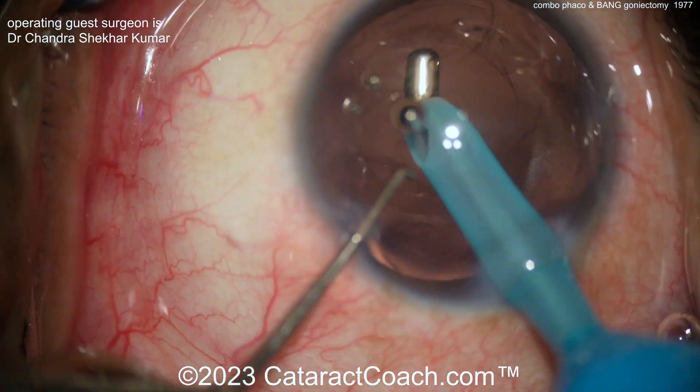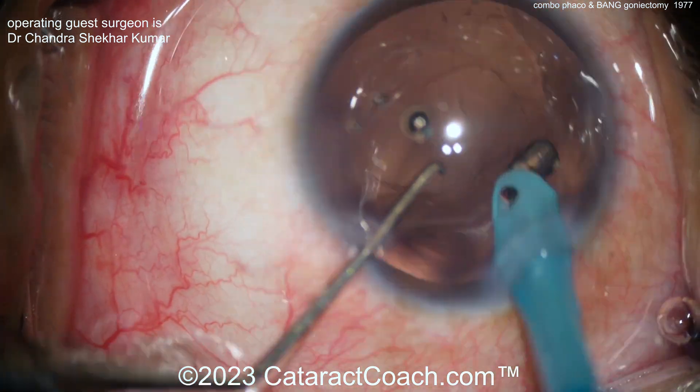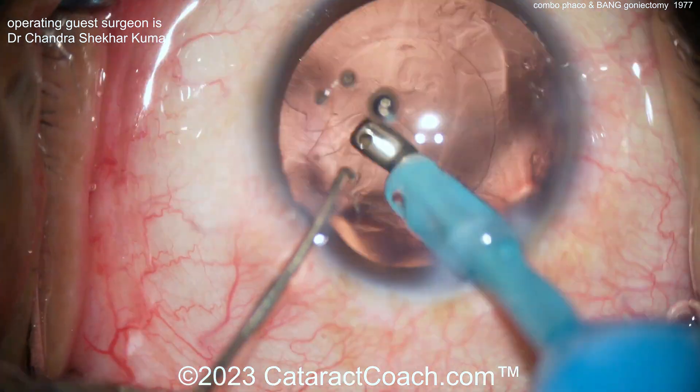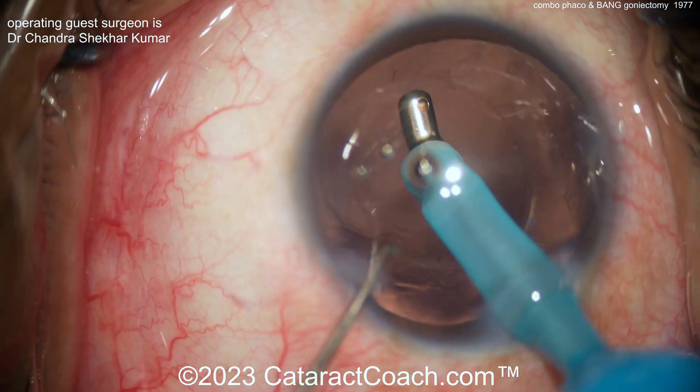One big advantage of BANG is it's very low cost. All you need is a bent needle, and even in the USA where things are very expensive, that is very inexpensive.